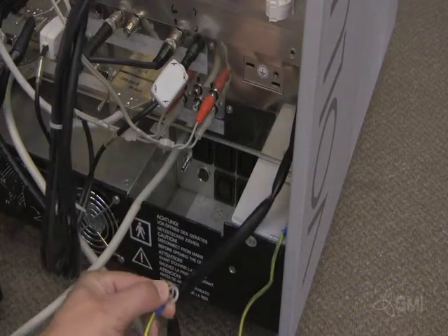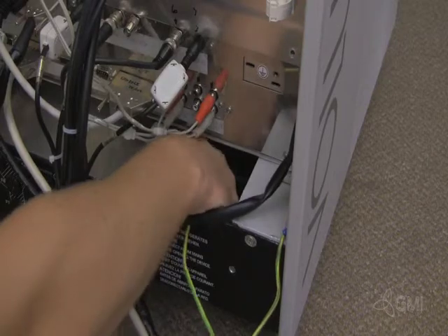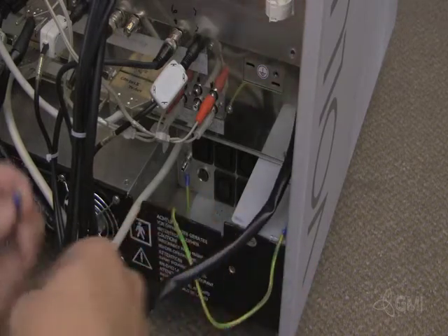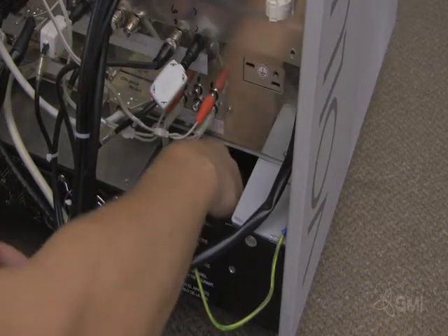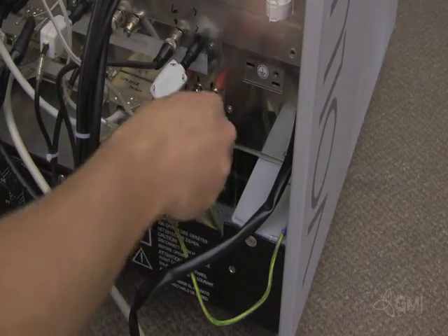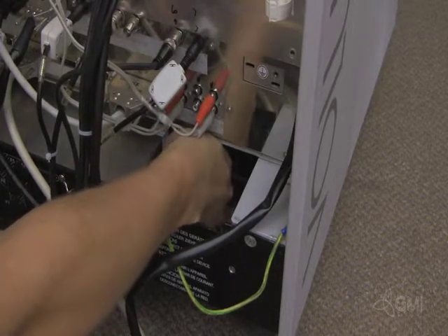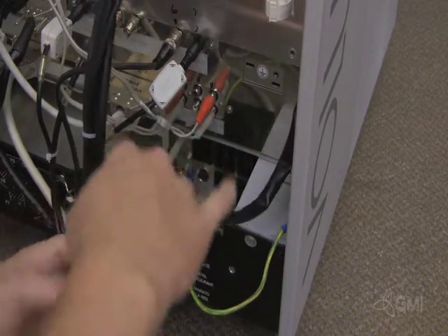Secure the ground cable to the main power supply. Replace the AC power cable to the main power supply.